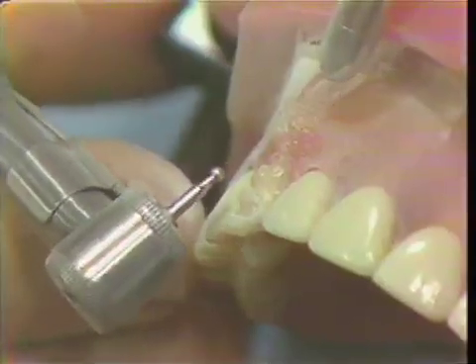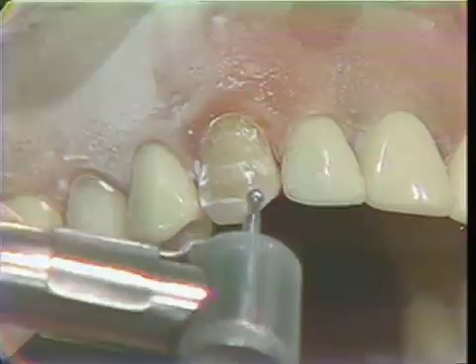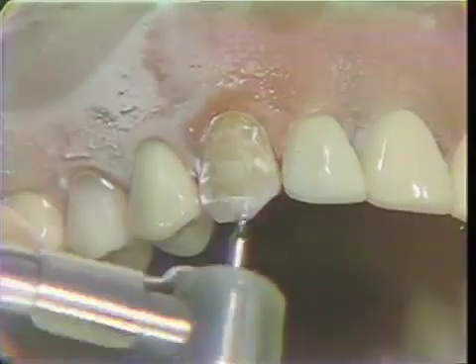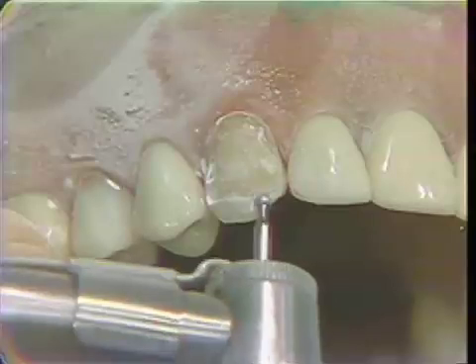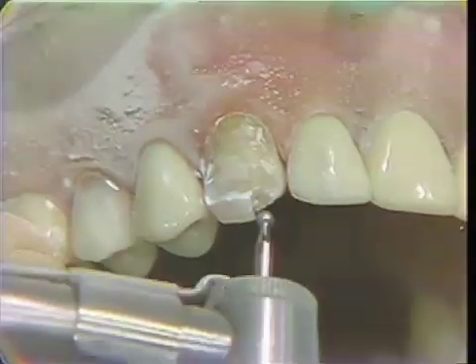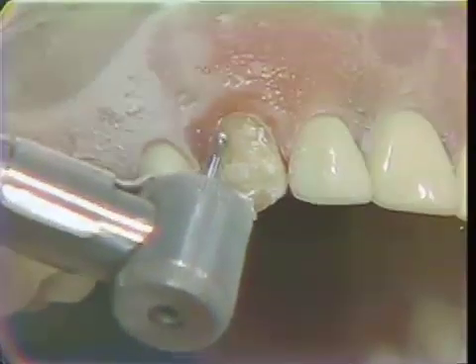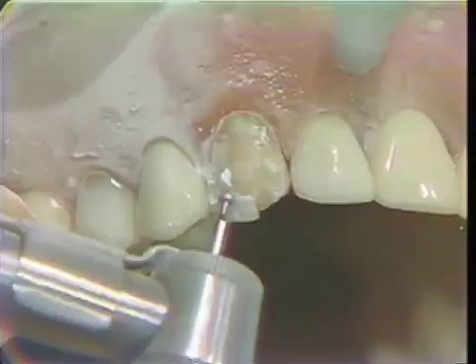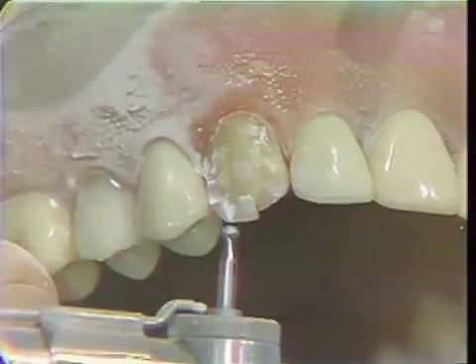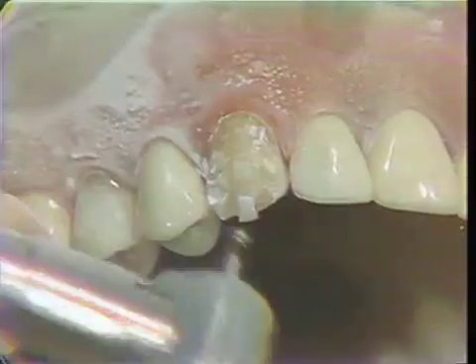Now we will make our vertical cut. Then we will come to the incisal edge, the full depth of the diameter of the diamond, and then we will make another vertical cut. Then bury this again the full depth of our diamond.